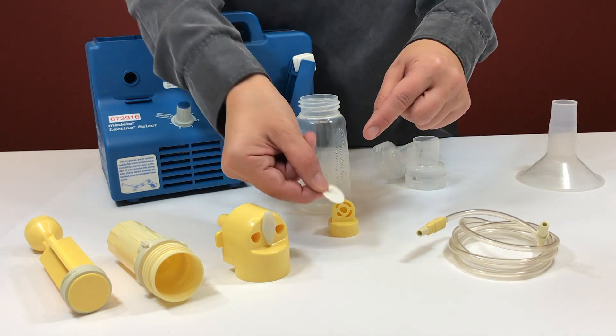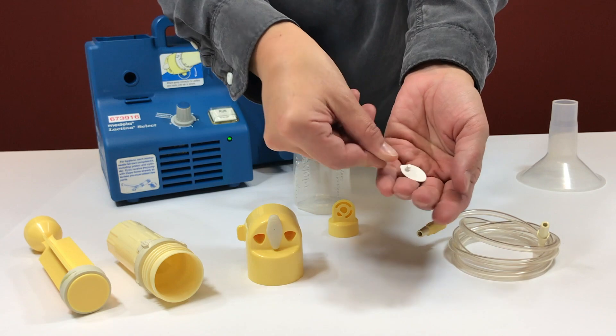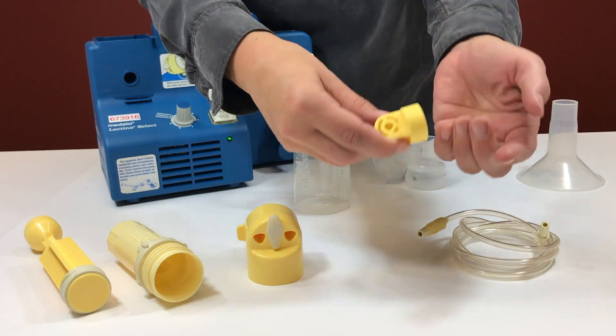Get the white rubber cover and place it flat on the yellow valve. It's important to make sure it's laying flat or the suction won't work.